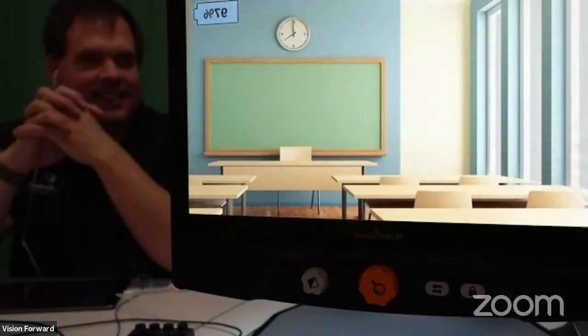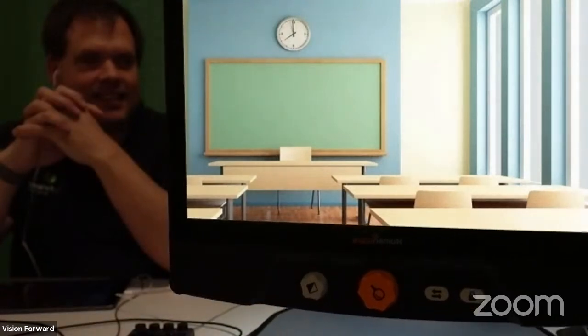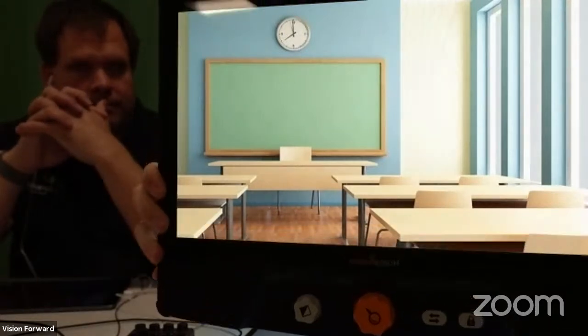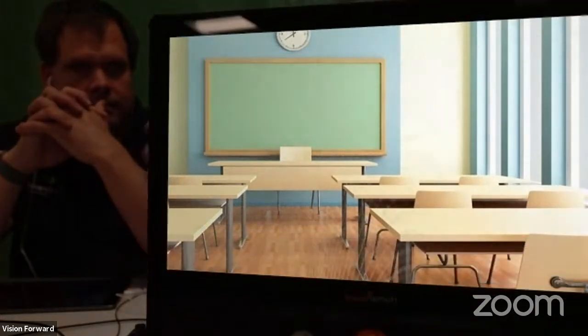This is the Reveal. Now, this is very, very close to the camera. It looks huge, probably. I lost my headphone in the process here, I do apologize. Okay, so here's the Reveal 16. I don't want to show too much here because the software is very similar to the Connect 12, but this is in a foldable desktop electronic magnification format.